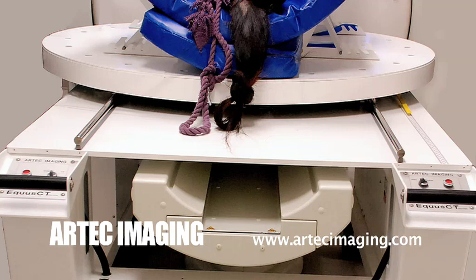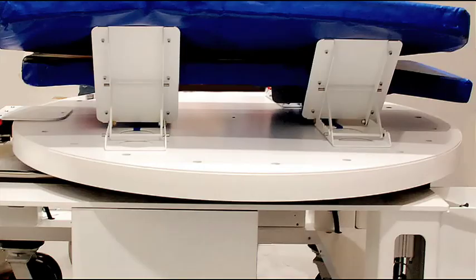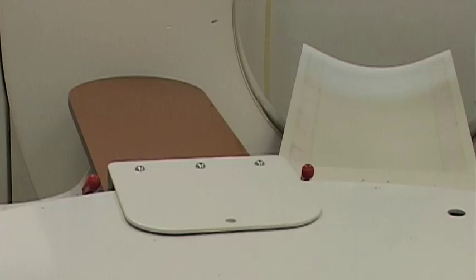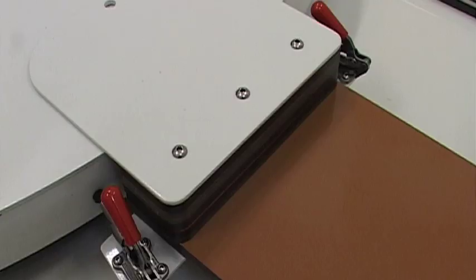A floating carousel offers superior maneuverability and makes it possible to finely position the patient with the CT gantry for scanning. The Equus CT has legs and head supports that are easily attached to the carousel and can be placed around the outer perimeter at any location for optimum positioning.